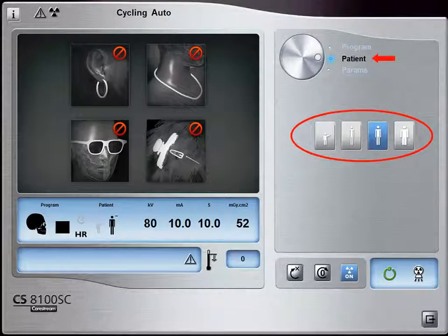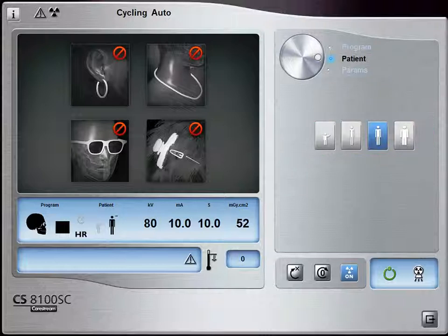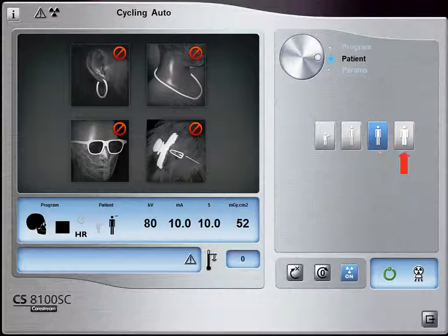In the Patient pane, select the patient type according to the patient's jaw size. The selection automatically adjusts the KV, MA output and time of exposure, and determines the trajectory length. Choose from the following patient types: Child, Adult with small jaw, Adult with medium jaw, or Adult with large jaw.